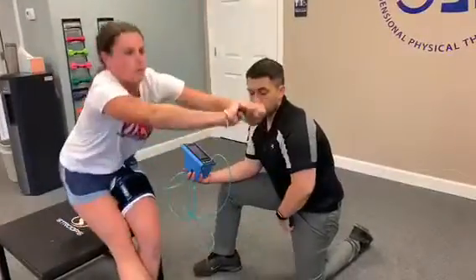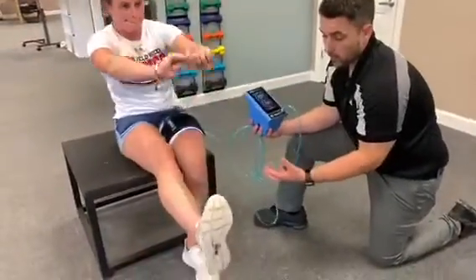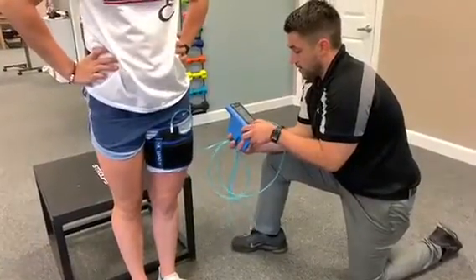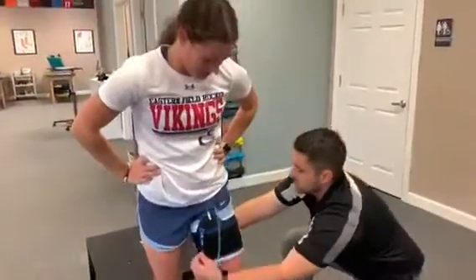The cuff has been occluded the whole time. As you can tell, her muscle is getting a little bit bigger — there's some swelling in the area. We call that cell swelling; these are all things we're looking for. On this last set, we're going to deflate the cuff.